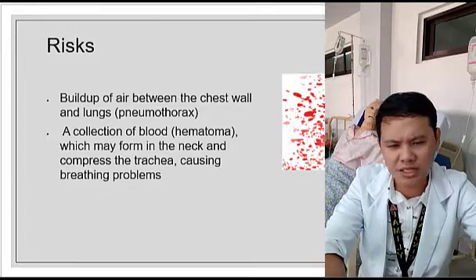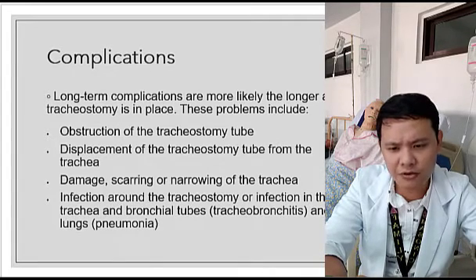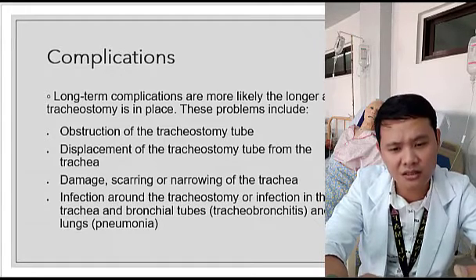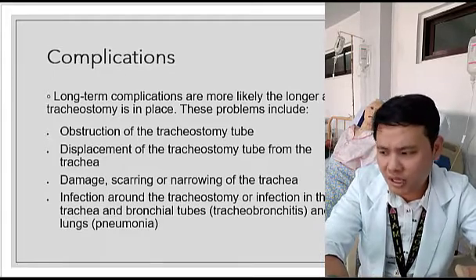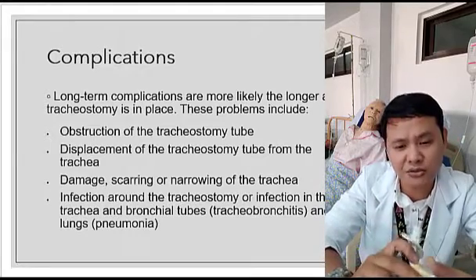Okay? What else? What are some other complications? Well, long-term complications are more likely to happen for longer use of the tracheostomy. These problems may include the obstruction of the tracheostomy. Okay, pwede magkaroon ng obstruction dun sa may tracheostomy. Obstruction from what? Obstruction from the secretions.